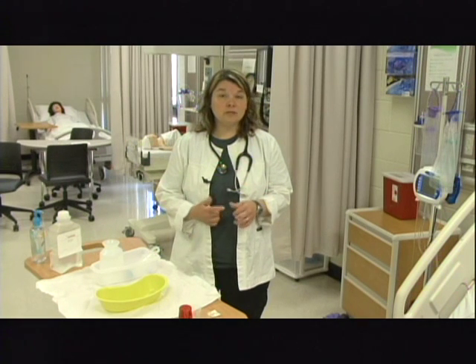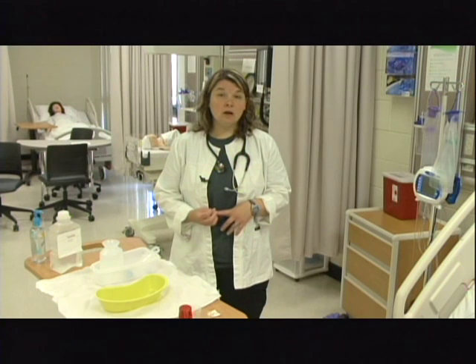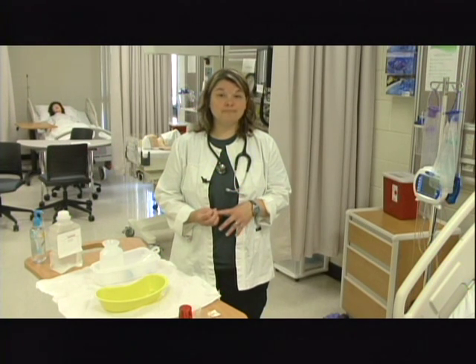I also need to know if the patient's on suction or if they're getting tube feed, since I'm actually giving tube medications. Also, what type of tube the patient has, okay?